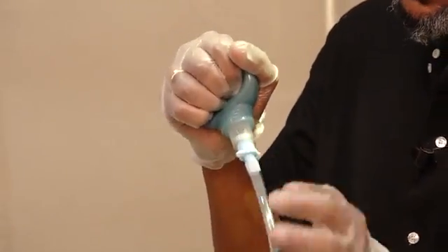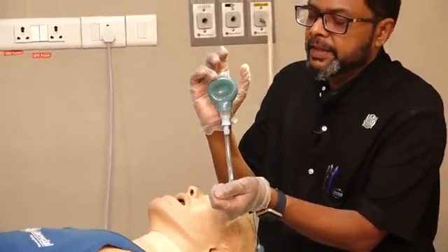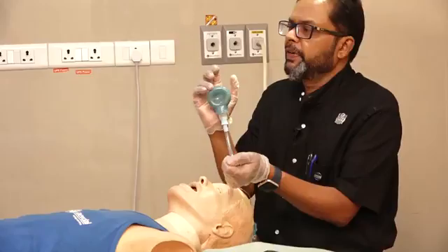If you squeeze it and it is not reinflating, it means the tube is in the esophagus.